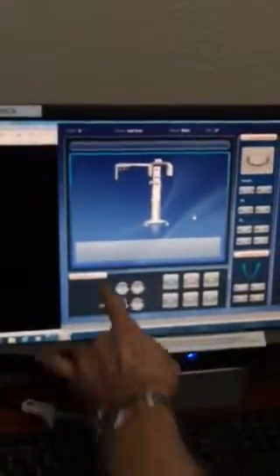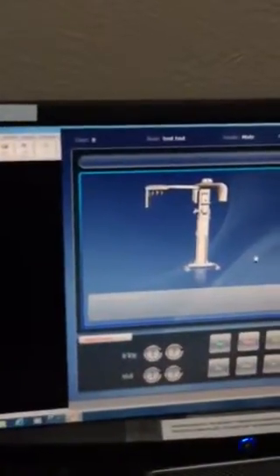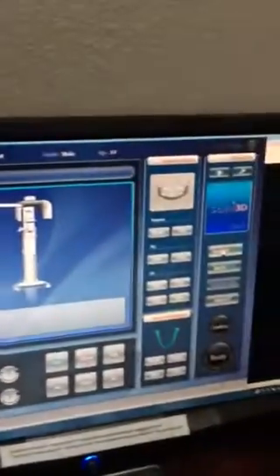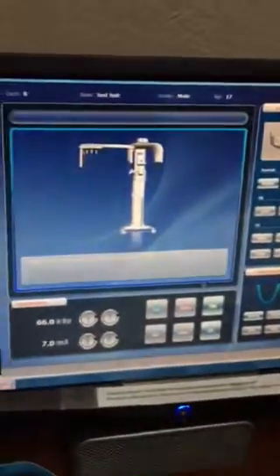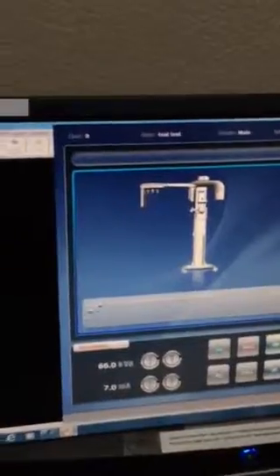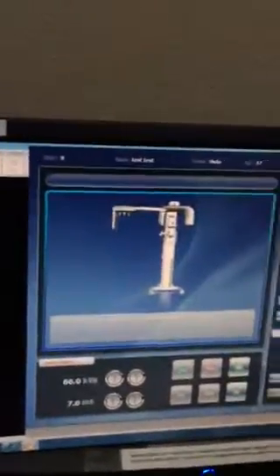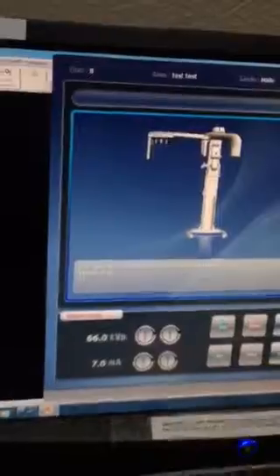Okay, so first thing first is select mode. And again, follow what it says on that little screen. I'm going to just do a standard pano. It's going to be normal. I'll just put child and soft. That's for default. So then it says confirm. After choosing capture mode, I'll click confirm. And it says the system is moving to capture initial position. Please wait. And as you can see, it is.